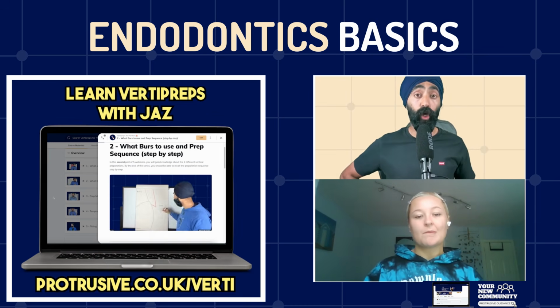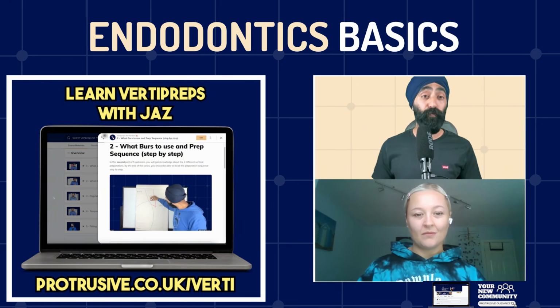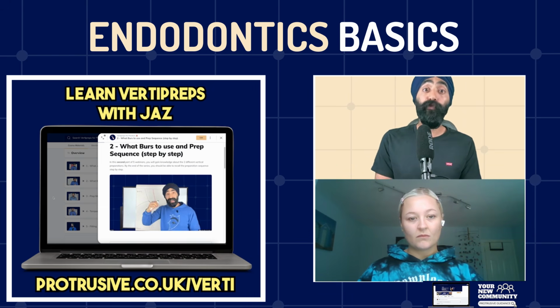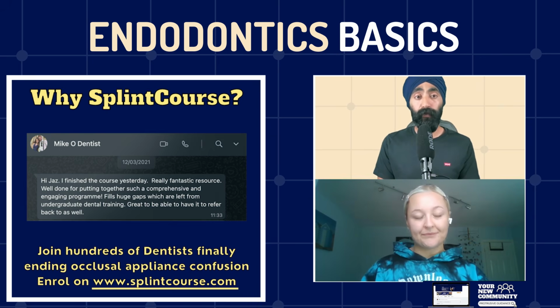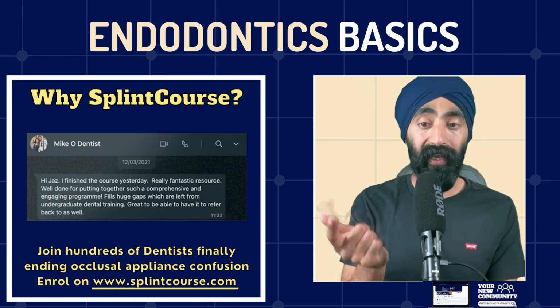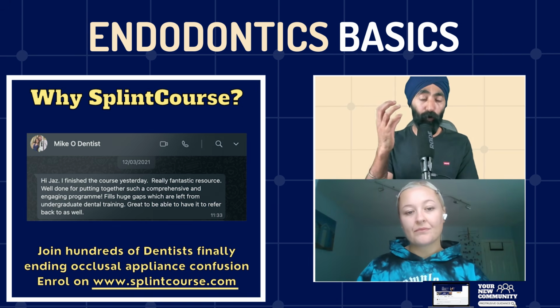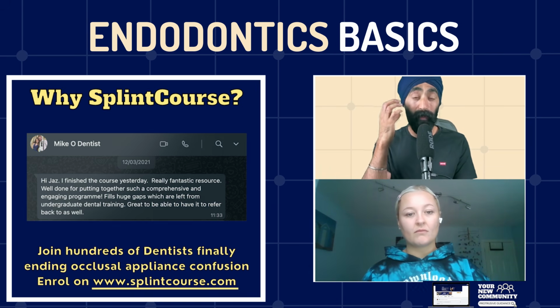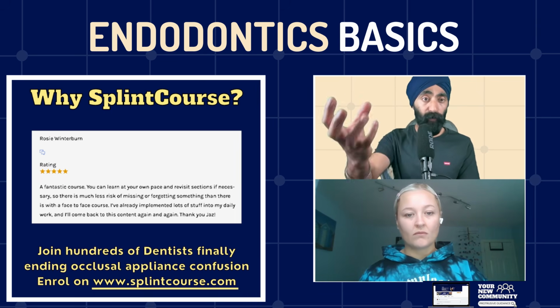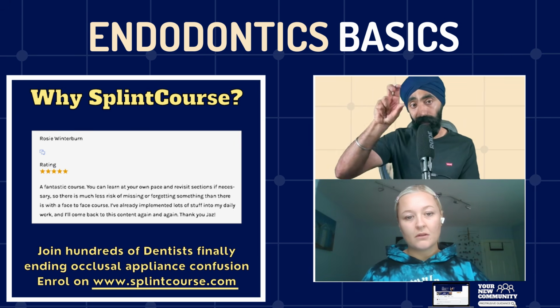Rubber dam isolation, doing it properly, not just for the radiograph. Using the correct solution. If you get the basics right, it's like Pareto's principle: 80% of your effect comes from 20% of endodontics. The 20% of endodontics that has the 80% effect is rubber dam isolation, using hypochlorite, and respecting the structure of the tooth and not being overzealous with being conservative. If you do those three things, then that is the Pareto principle of endodontics. You get 80% of success by just doing those three things.